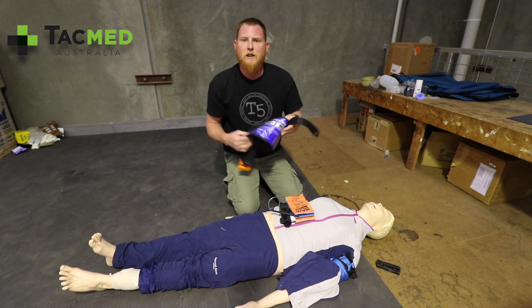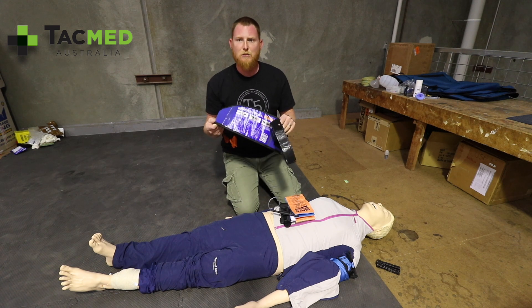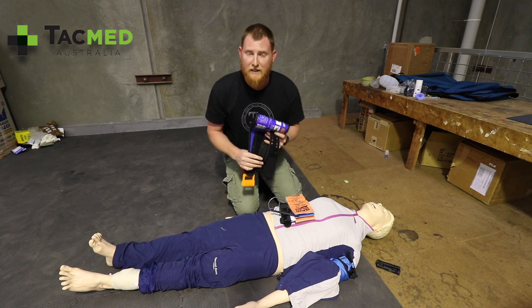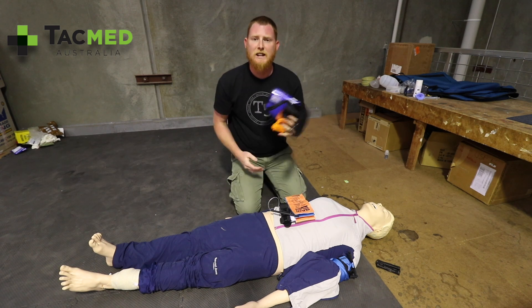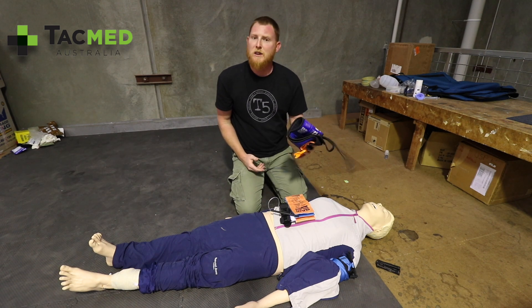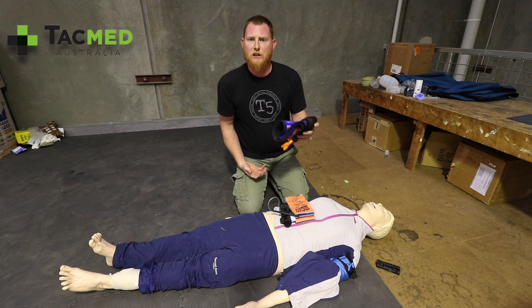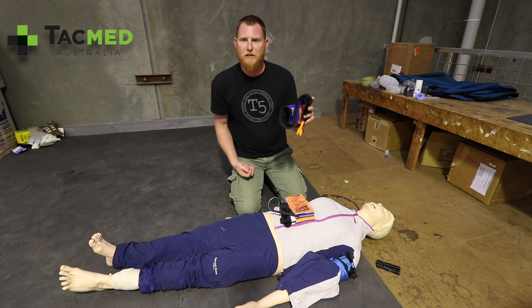One of the ways we can minimise bleeding into the pelvis is by splinting that pelvis together, bringing it back to its natural alignment — especially for open-book pelvic fractures. The pelvis won't spring open, but it could be loose and the feet will be splayed apart. This is very common with pedestrians hit by cars and motorcyclists.